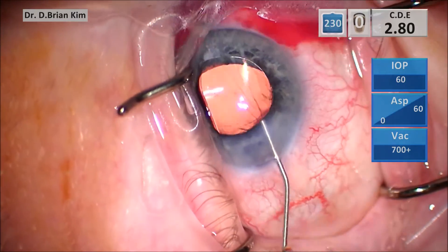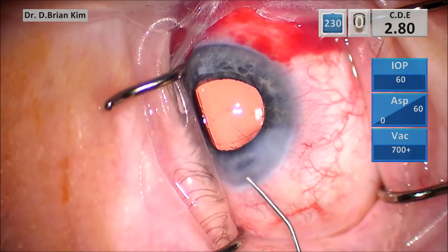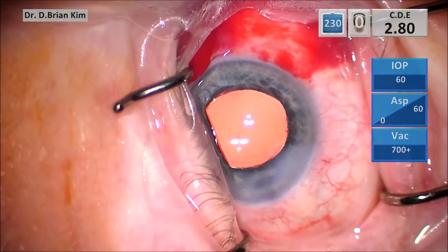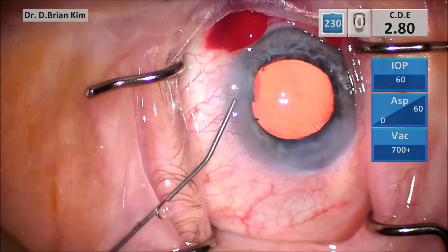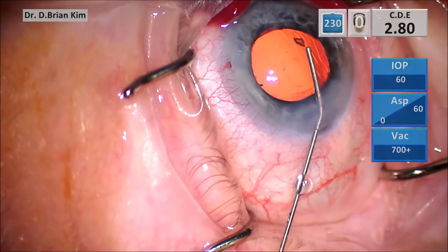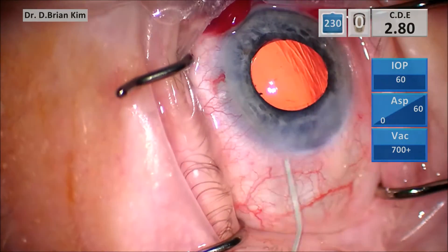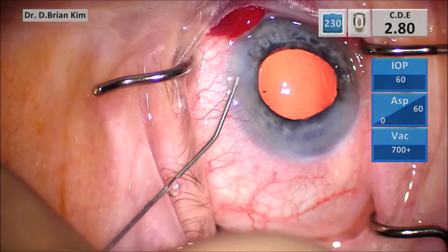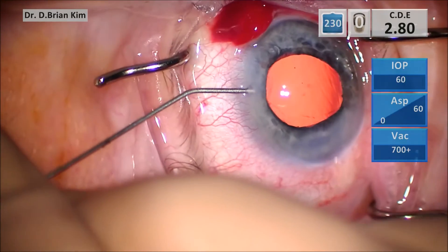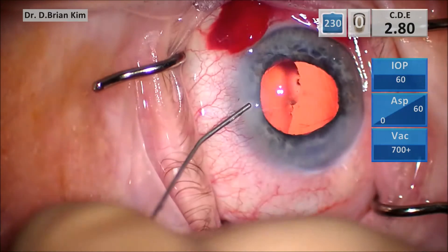You can see that the optic is definitely captured by the capsular rhexis opening. This is very important — you don't want to over-inflate the anterior chamber, because if you do, that lens will just prolapse right back into the capsular bag. Here there's a small fragment; I'm going to withdraw the plunger to hold that piece along the cannula tip and remove it. You don't want to over-inflate. Nasally, the optic is captured by the iris, not just by the capsule.